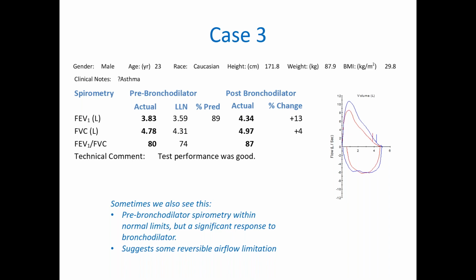But obviously, probably one of the other really important things to think about is that we never make a diagnosis based on spirometry alone. So there needs to be some clinical correlation as well.